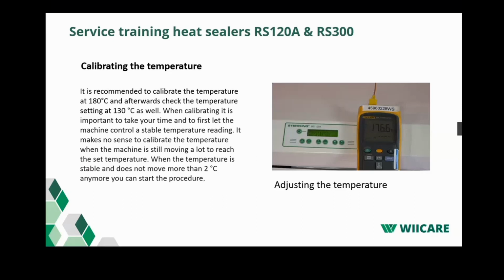Okay, this is the actual video which I just wanted to say. That's how to calibrate the actual temperature in the machine. So you measure on your thermocouple, and you want to make sure that the reading you get from your Fluke device corresponds with the reading you have in your display. When you do this, first make sure that the temperature is really settled.